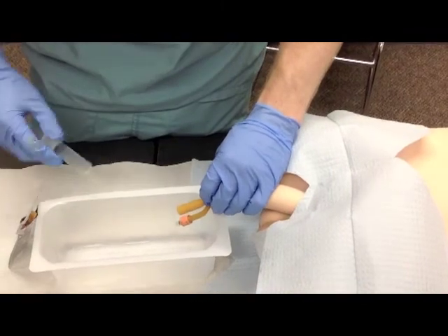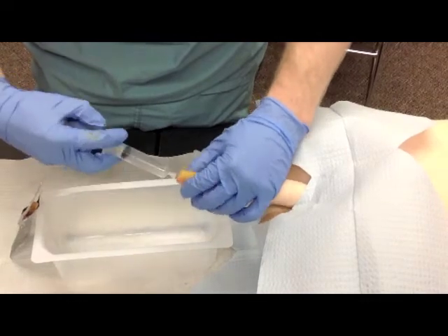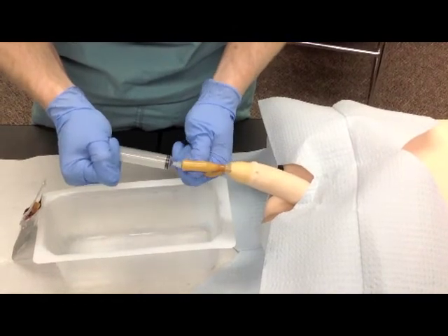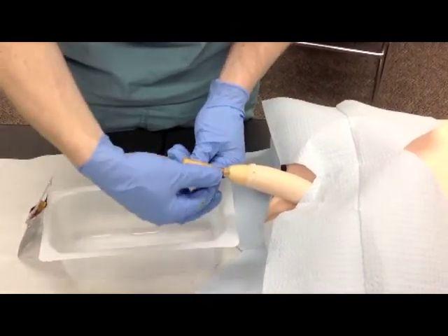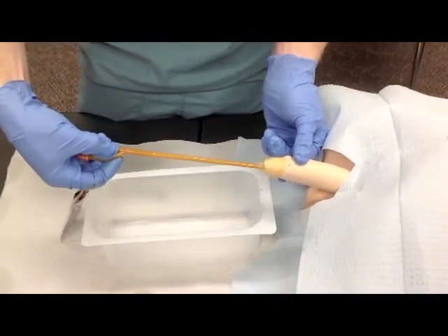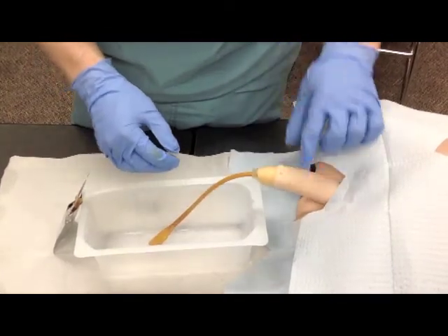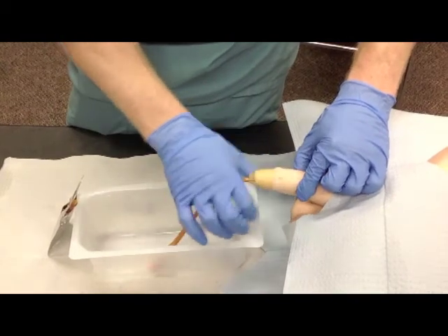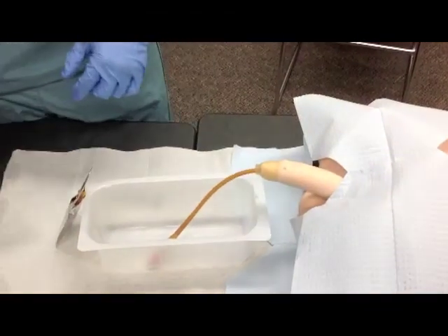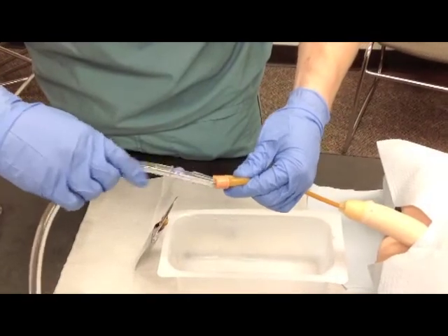When proper placement is confirmed, inflate the retention balloon using your syringe of sterile water. After inflation, gently withdraw the catheter until the balloon meets the bladder neck, and ensure the catheter will not spontaneously dislodge. In uncircumcised males, you must reduce the foreskin after catheter placement. This prevents the development of paraphimosis. The final step is to now connect the catheter to its catheter bag and to clean up after yourself.